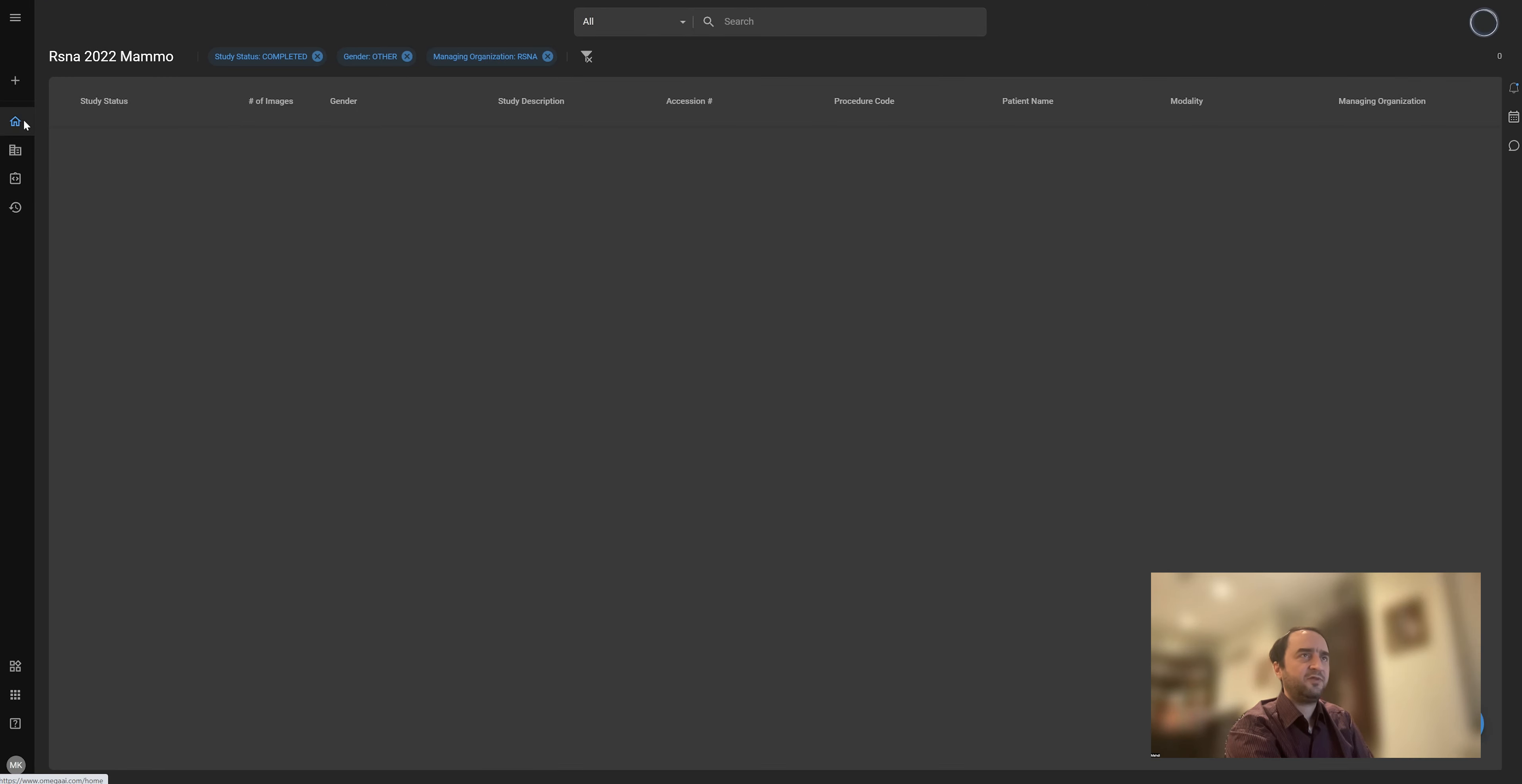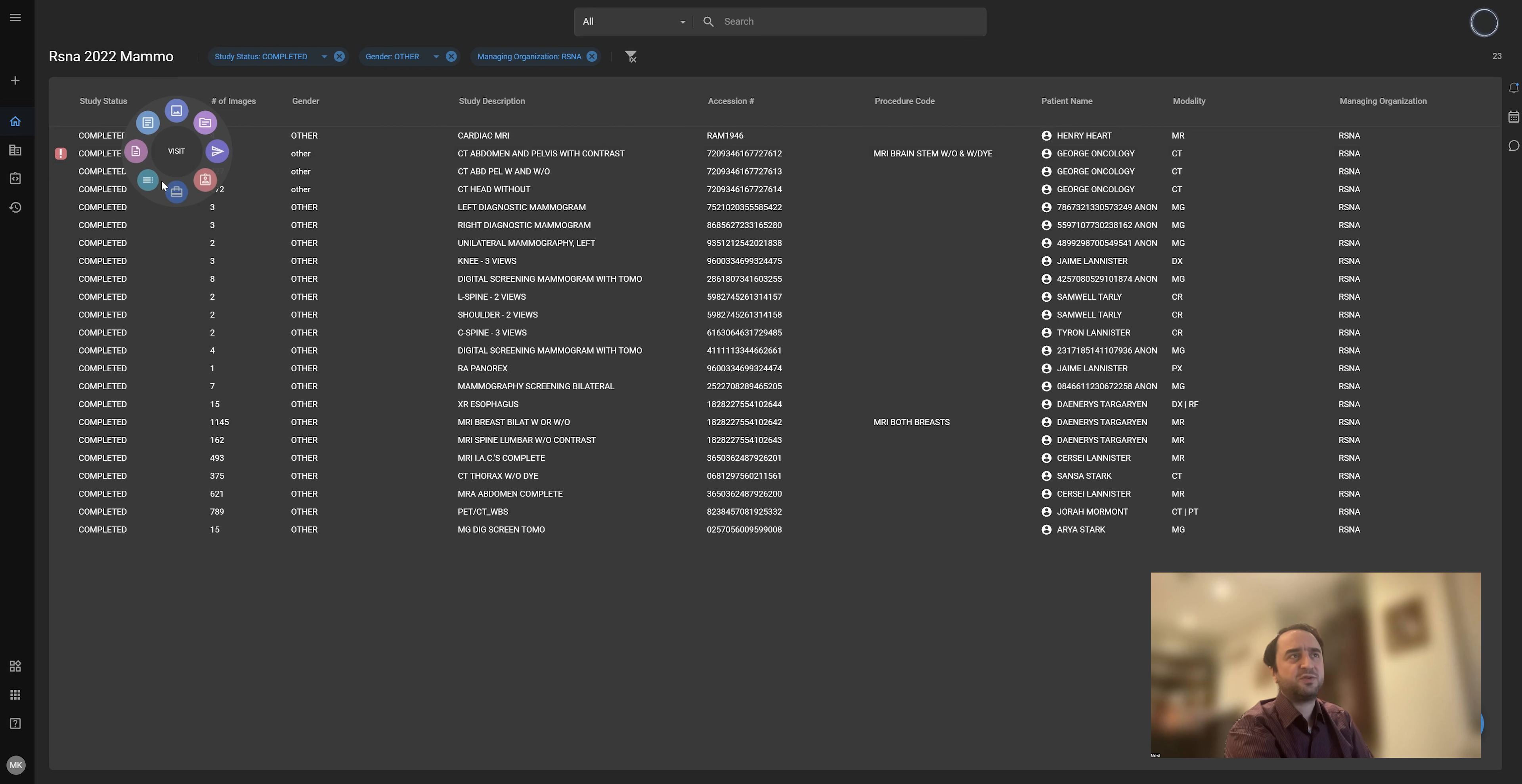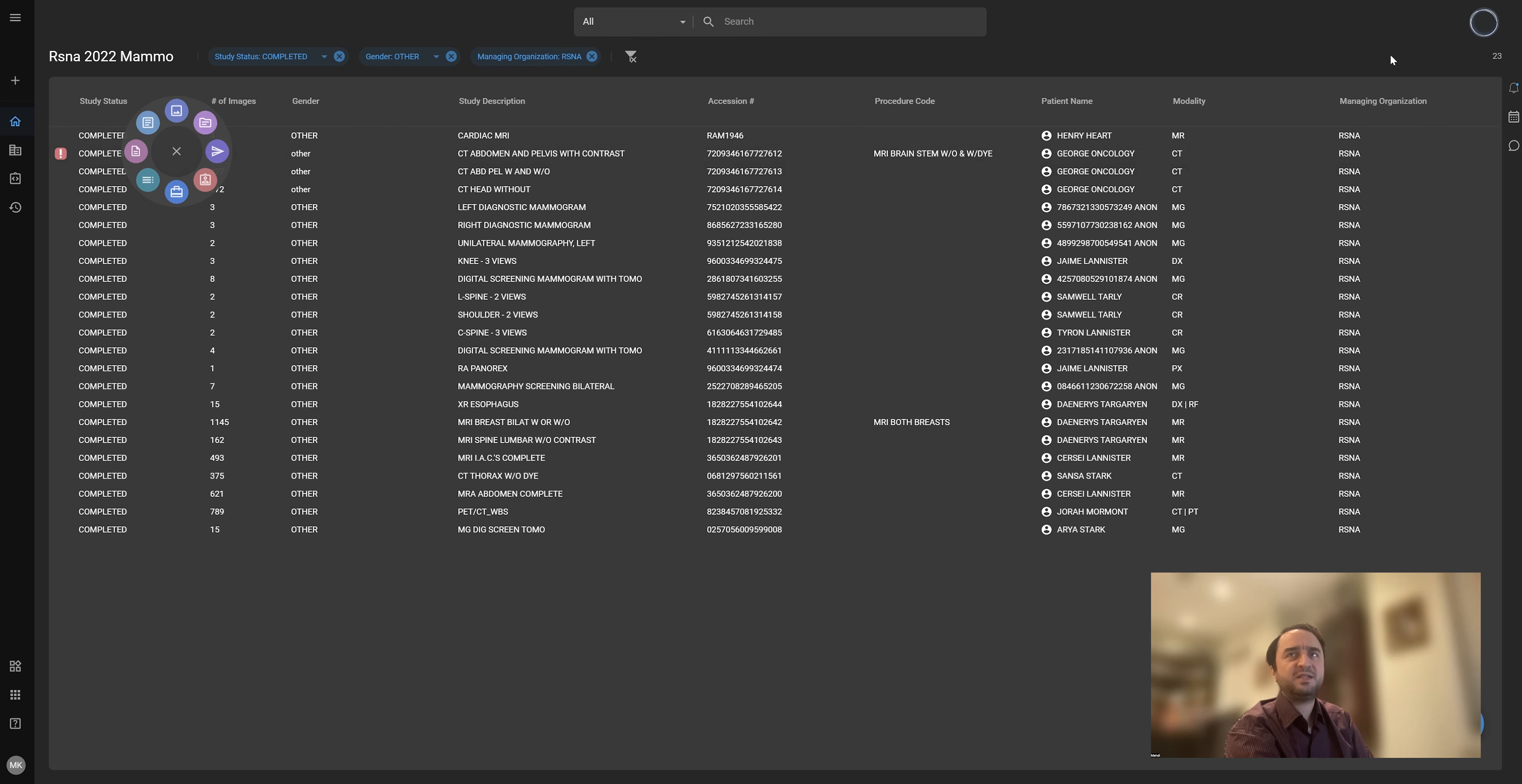Finally, the worklist itself also got a lot of positive feedback. You have access to all the actions you want to do about the studies using this wheel.